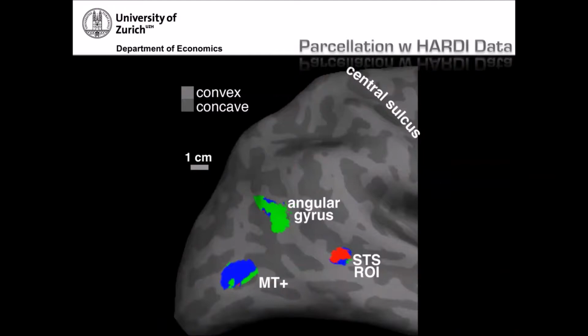So there was some signal in the gray matter that you can reproducibly measure. And of course, this is not very useful yet, because you first have to know the regions of interest from which you extracted the data for the training. But nevertheless, it was interesting for us to show, and now based on this, we would like to further develop this technique.